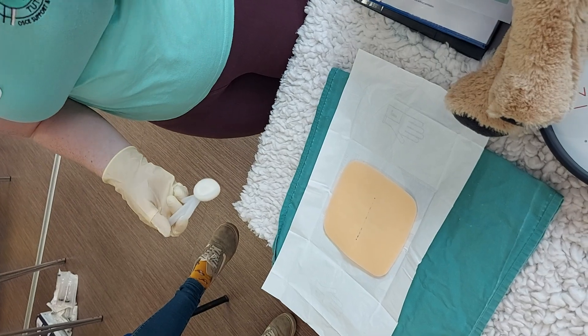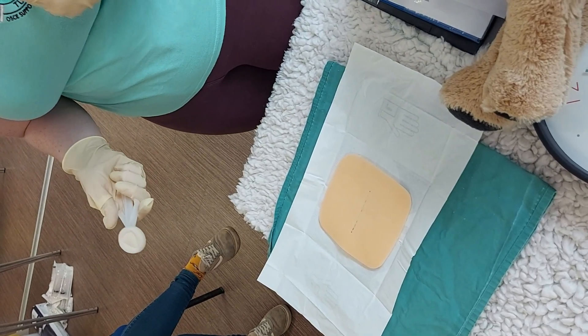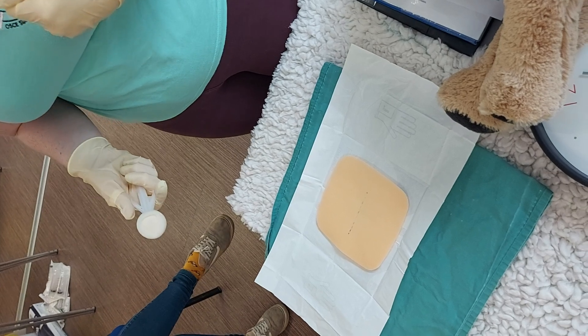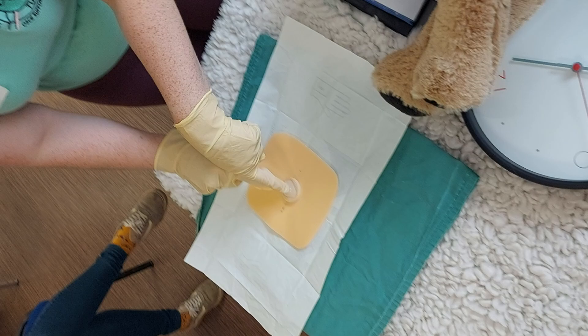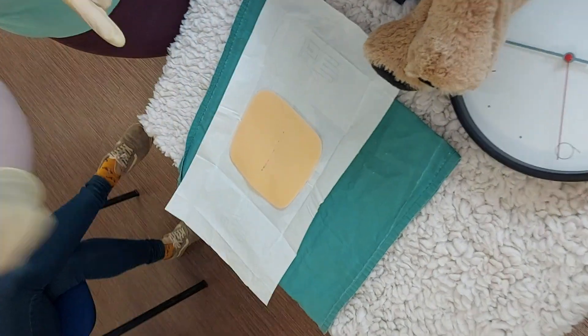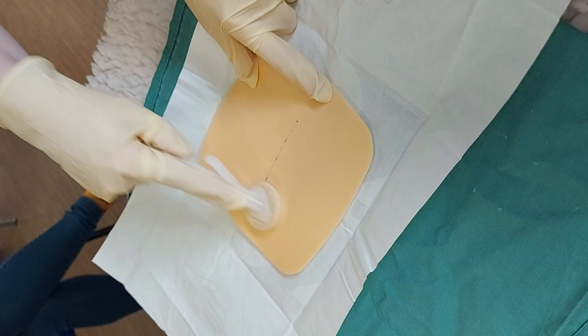Just wait — I'm actually going to wait until my second hand is on the zero or the 30, because that's really easy. Once it's on the ready time, aim it away from you, keeping the dial basically facing away from your hand. Then go in a hashtag fashion.